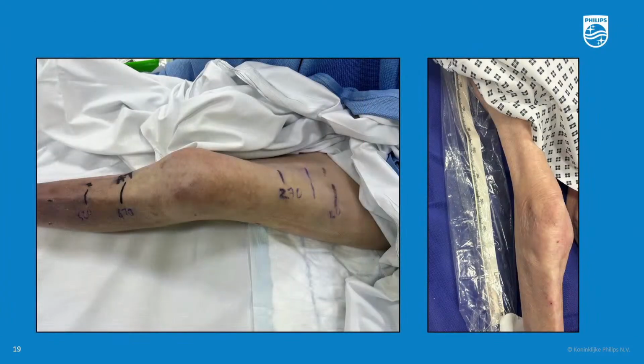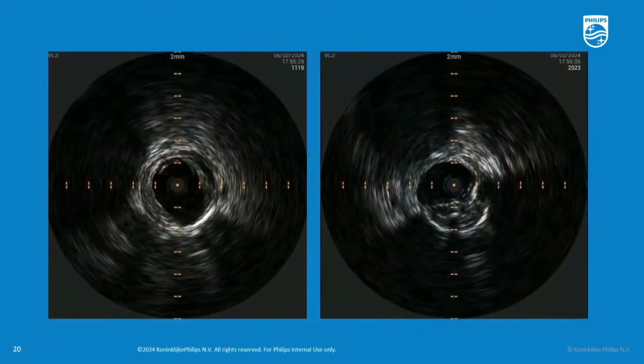I didn't actually do this on an unsterile leg. I did it so that I could get a photo and show you the idea. Actually, what I tend to do is to do it on the drape, over the leg. It's where I tend to mark it. And that seems to help, if anything, just to know what the numbers are. But you can see the radio-opaque ruler and how that might fit in underneath the mattress.